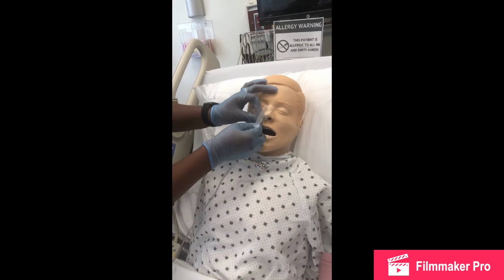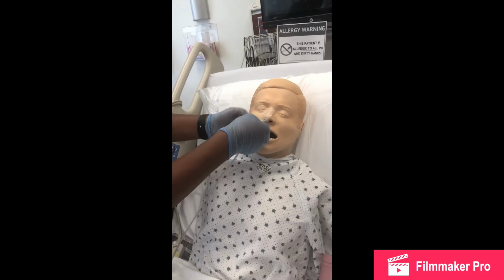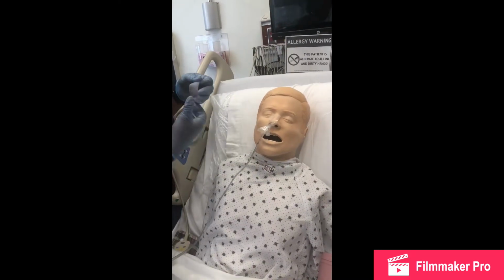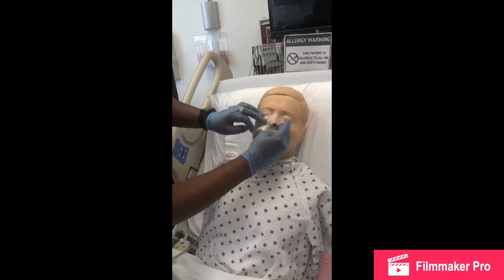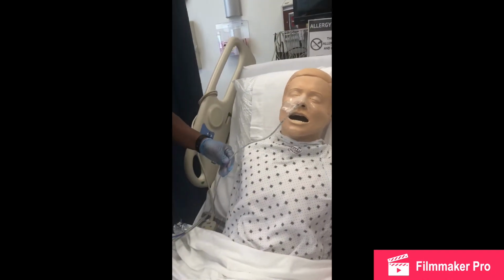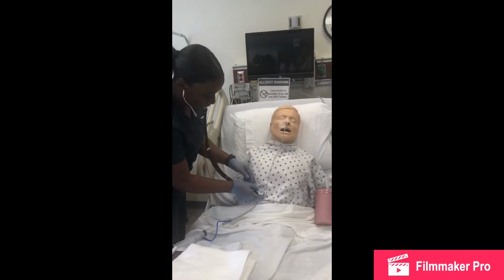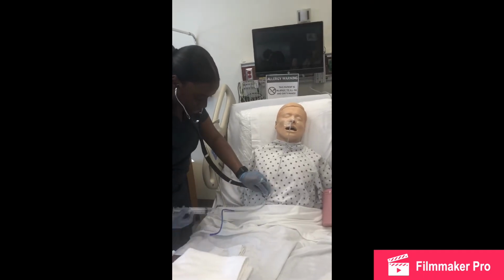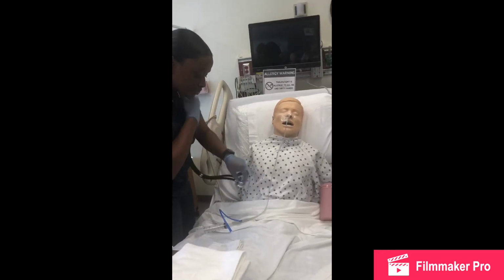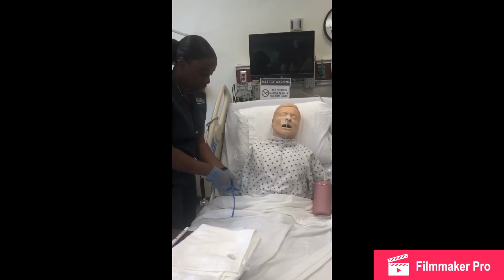Wrap this around this corner. Then I'm going to carefully place this one above across the nose to secure this one. After that is secured, I put my stethoscope in and insert my 30 cc's of air, making certain that I hear the swishing sound. Detach my syringe carefully, not to make any secretions spill.